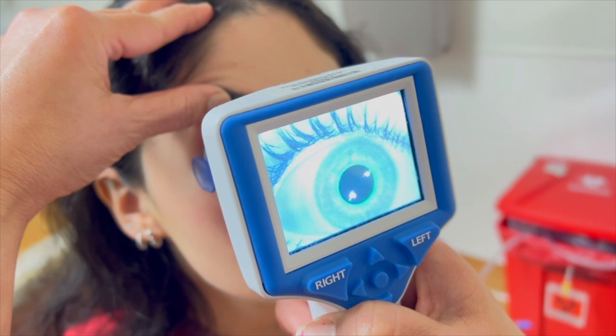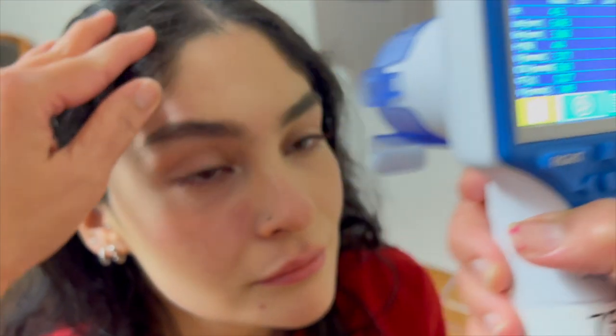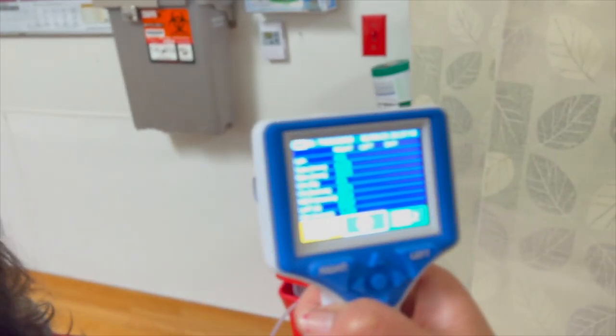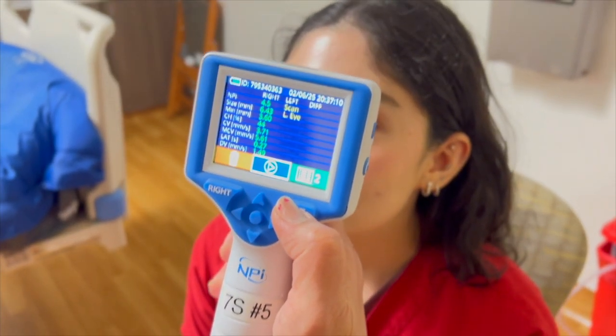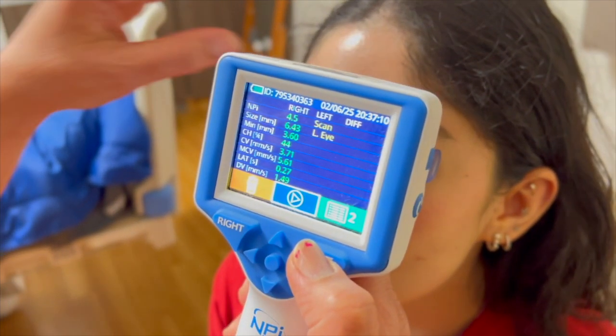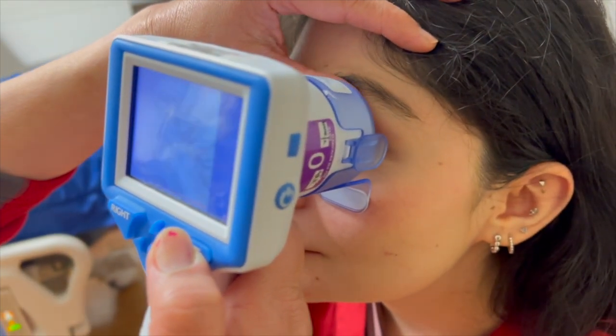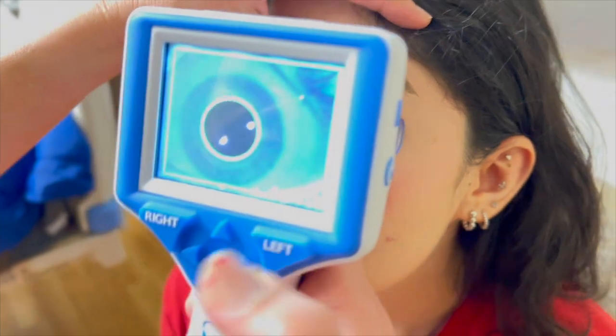Press and hold the corresponding right or left button and reposition the Pupilometer as needed, avoiding tilting, until the pupil is centered on the screen and encircled by a green ring. A green frame around the screen indicates the pupil is properly targeted, while a red frame indicates the pupil needs to be re-centered before the measurement is initiated.